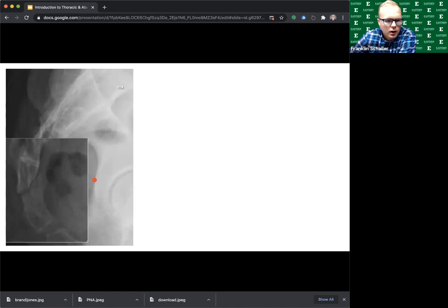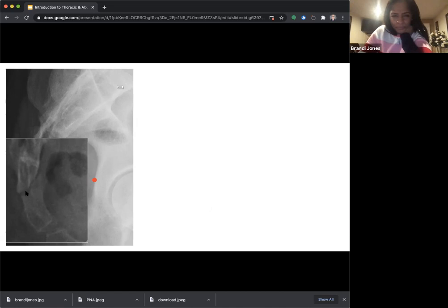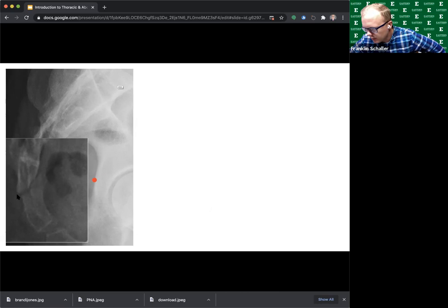All right, 49-year-old female fell onto her buttocks after slipping on the ice while taking the trash out to the curb this morning and comes into you complaining of tailbone pain. On exam, you're noticing very mild edema and tenderness to the tailbone area on palpation. You get an x-ray of the coccyx. There's a large rectangle there, and it is zooming in. And I am seeing a fracture of the tailbone all through this area right here. That hurts. The vast majority of these heal up with no further intervention. Just got to help them out with pain control.